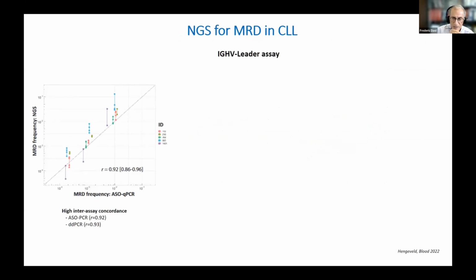So we believe that this test is almost ready to go for accreditation, but of course we will need to do everything that has been described by the previous speaker. Our colleagues from Rotterdam used this assay for evaluation of MRD. You needed to add a few things, and they compared it to what they used in the lab, which is either digital PCR or quantitative PCR. And you can see that there's a very good correlation.